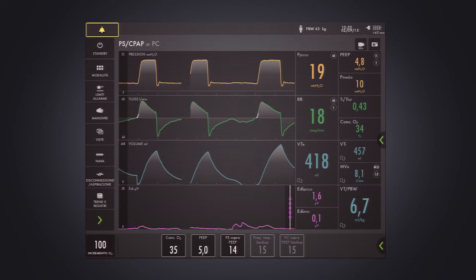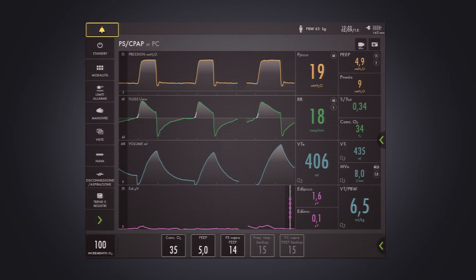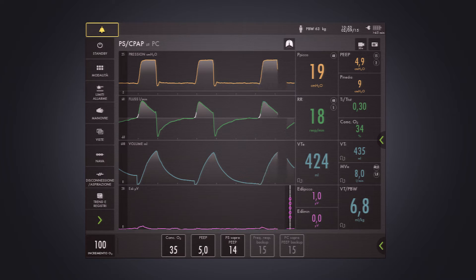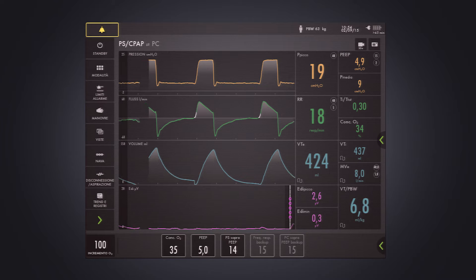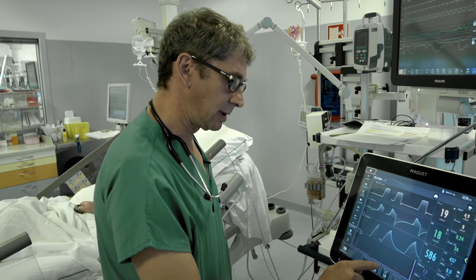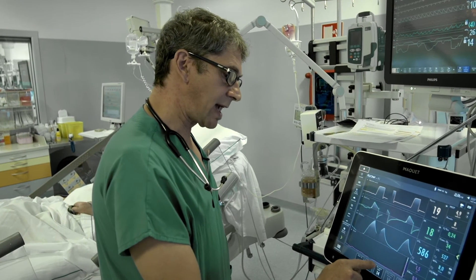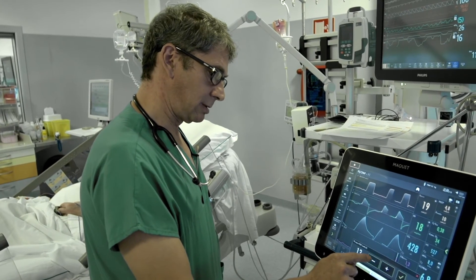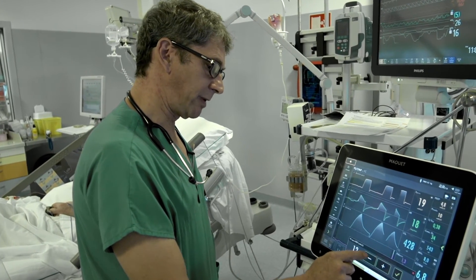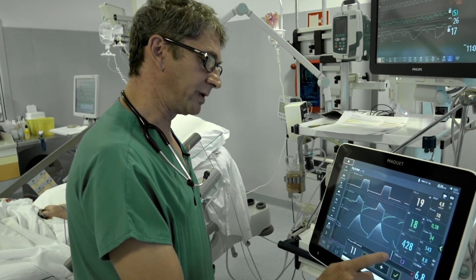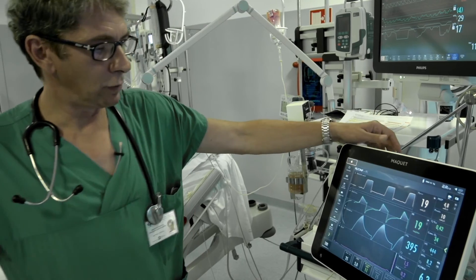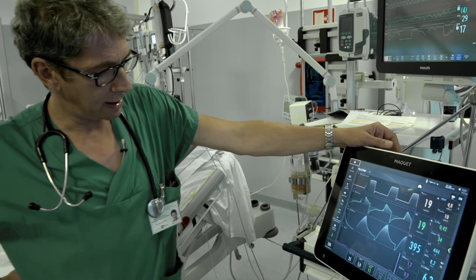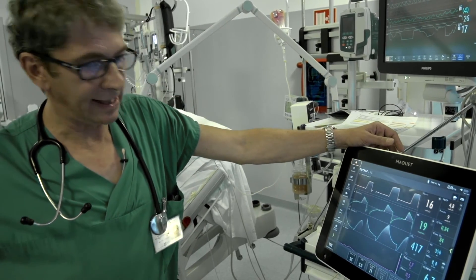So let's try to decrease the pressure support and see if we can see something more coming from the diaphragm. We'll go down in three centimeter water steps and we will look at the EDI signal.